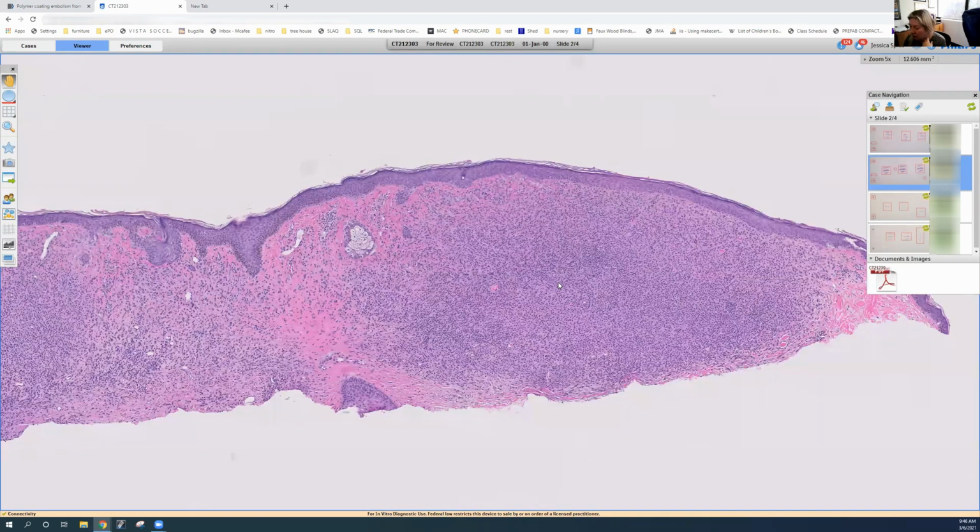And I would just say that the biologic potential of these tumors is still being worked out. Although the vast majority behave in a benign fashion, there are rare reports of transformation of BAP1 inactivated melanocytic tumors going on to behave as melanomas.